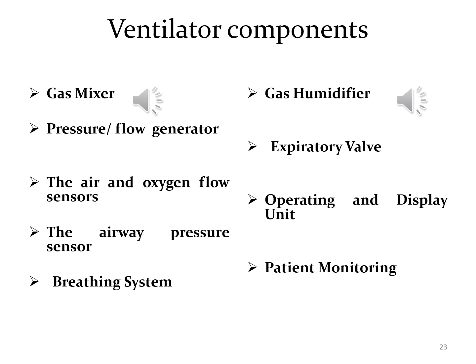A flow generator is a controlled valve whose output provides a defined gas flow. The output pressure is not specified. A pressure generator behaves similarly to a compressor whose output provides a defined pressure with an unspecified gas flow.